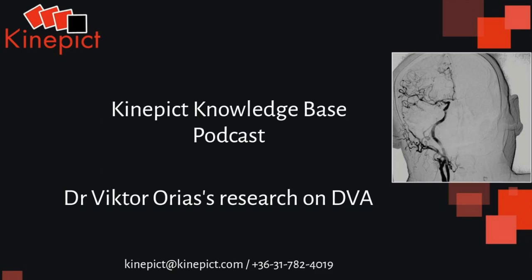Good afternoon. In this podcast, we discuss with Viktor Orias two papers that validate the use of a new imaging technology to support catheter-aided interventions in patients with iodine allergy or weak kidney function. Viktor, you played an important role in several initial clinical validation studies of the Kinepict DVA technology. One of these is about using CO2 as contrast agent in X-ray angiography.